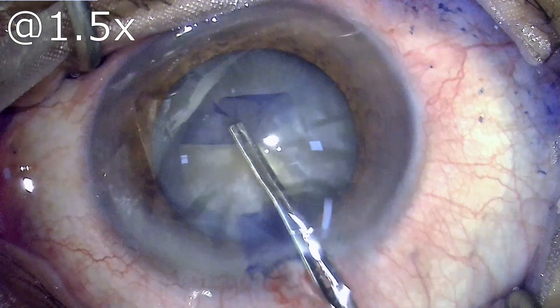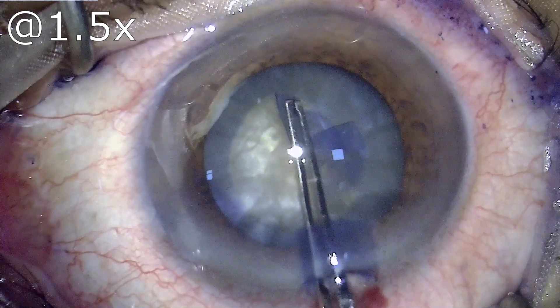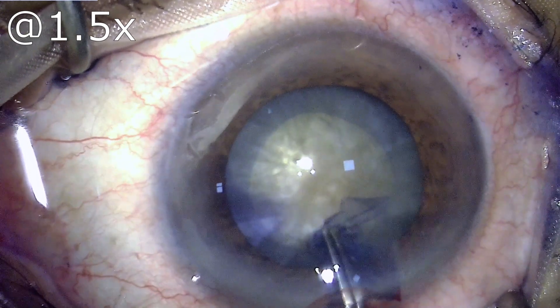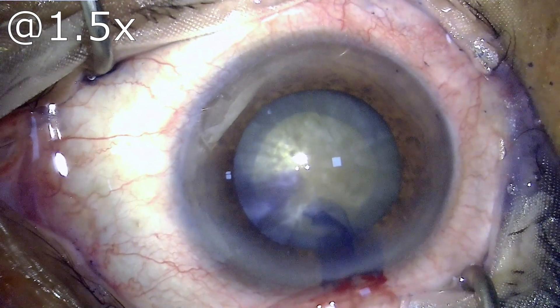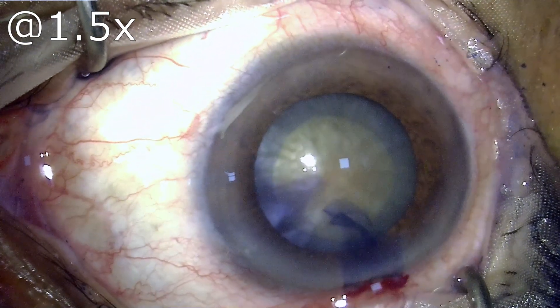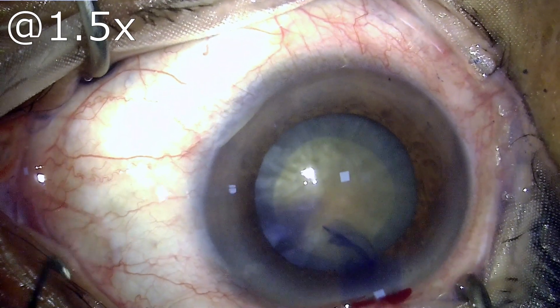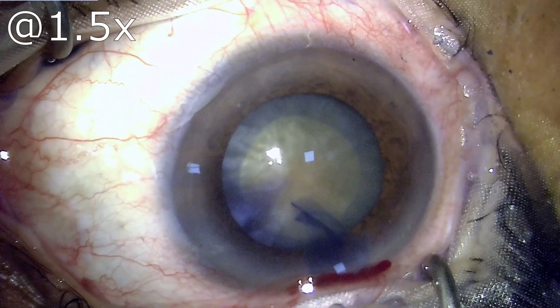It is one of the important steps to tear this capsule in a round fashion so as to have an uncompromised capsulorhexis. Once the capsulorhexis has been done, the time is to go ahead and emulsify the nucleus. These nuclei are bulky and hard, and that causes challenges.